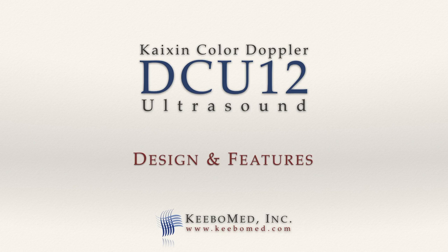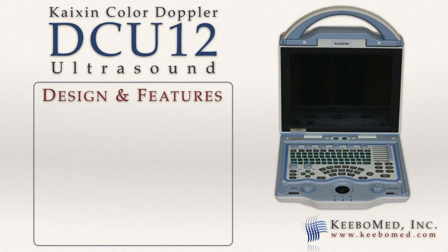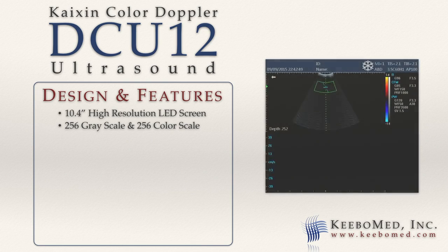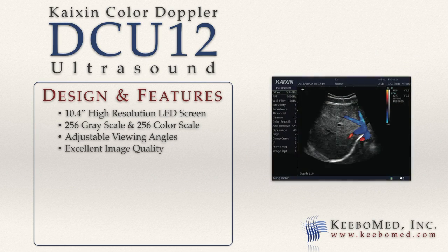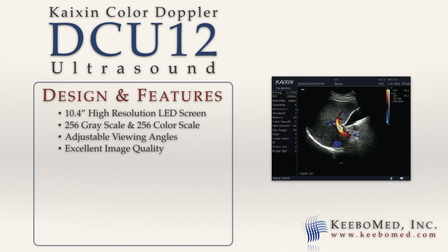The design of the DCU-12 allows for convenient use, and its many features provide much adaptability. The screen is a 10.4 inch high resolution LED with a 256 gray scale and a 256 color scale. The angle can be easily adjusted to achieve the best view. The image quality is excellent, comparable with ultrasounds that cost $10,000 and up.